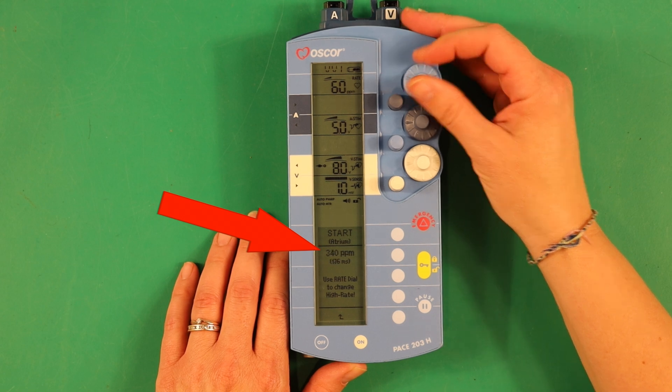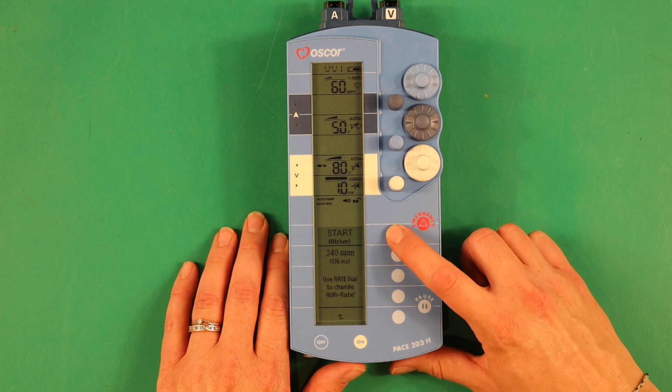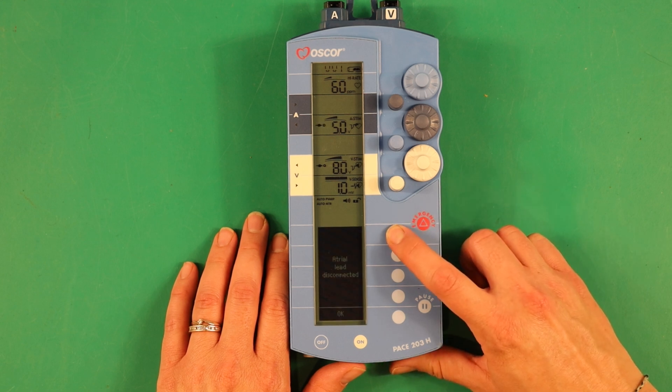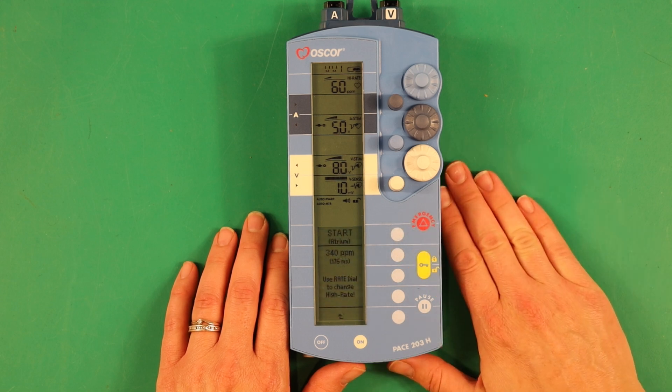Pacing will only occur while you are holding the start button down. During this time, the pacemaker is not sensing, only pacing, and will not be inhibited by the patient's own rhythm. I usually start about five seconds of pacing, but that's a made-up number.